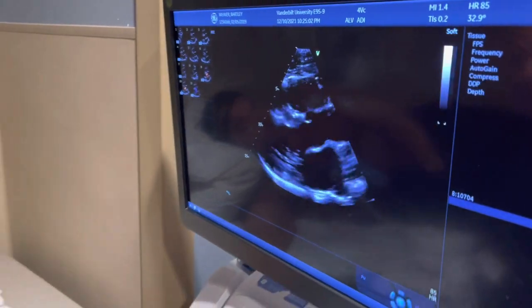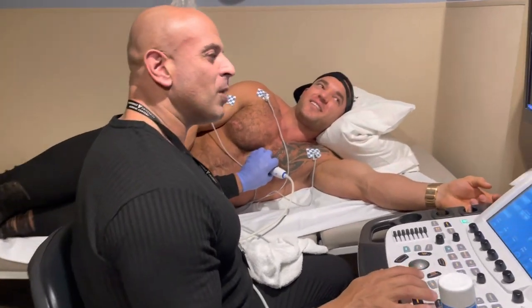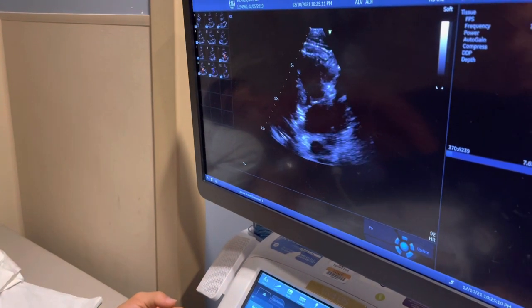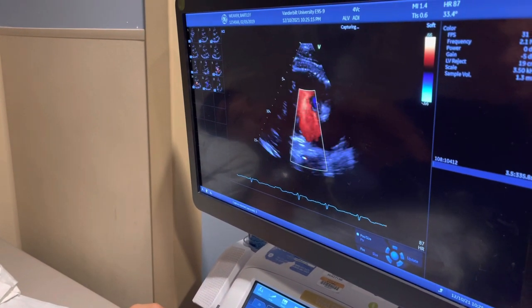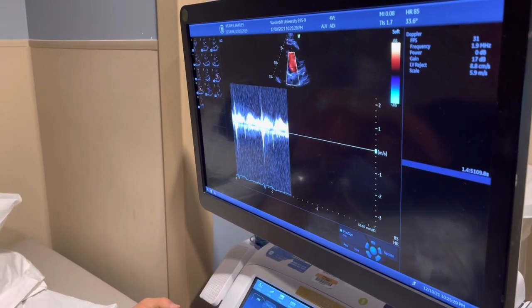Here's another valve — this one's on the right side of your heart: the tricuspid valve. We're going to see the flow through this valve. Looks really, really good. Very normal. I can put the sound on if you want.